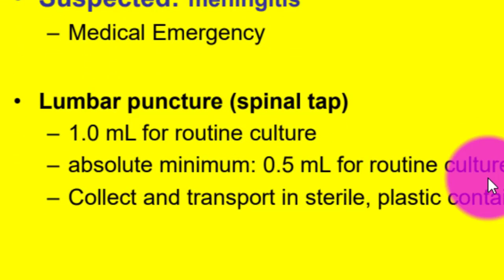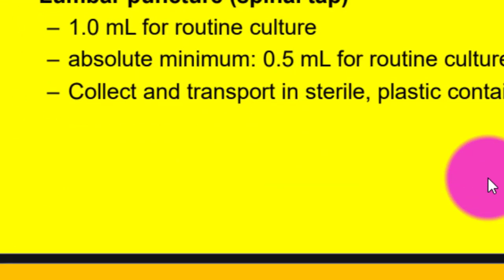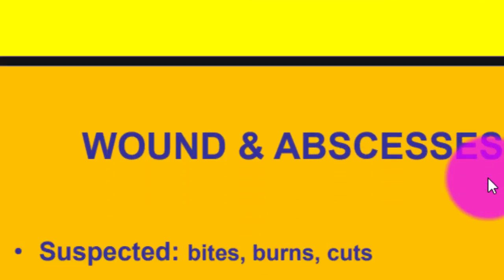Spinal fluid, suspected disease meningitis, a medical emergency. Lumbar puncture, spinal tap: 1 ml for routine culture. The absolute minimum is 0.5 ml for routine culture. Collect and transport in a sterile plastic container, as they need a specialized technique for obtaining this sample from special sites.